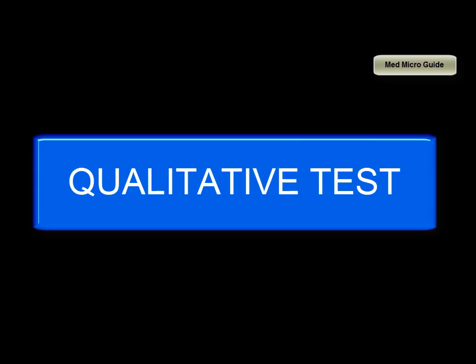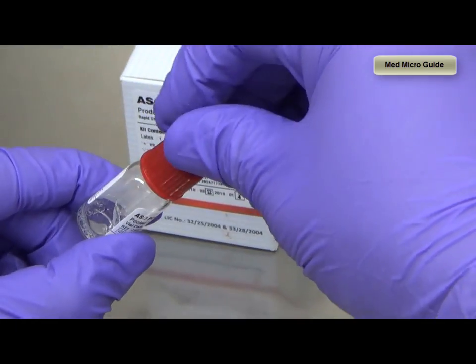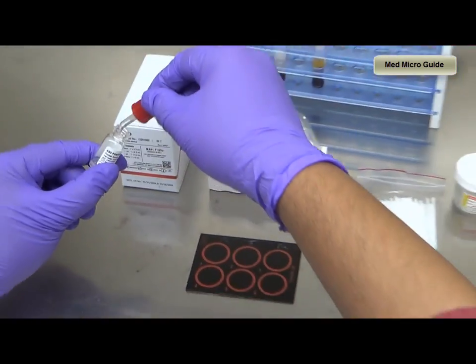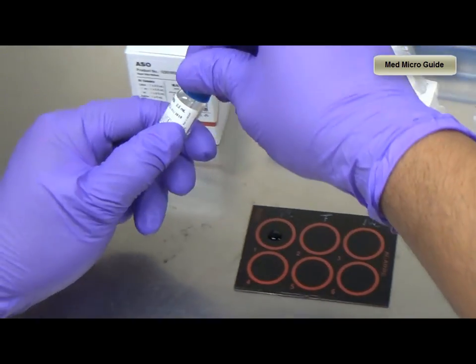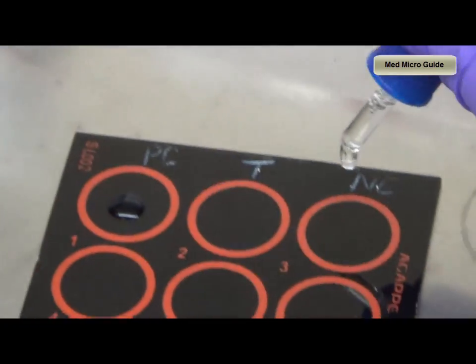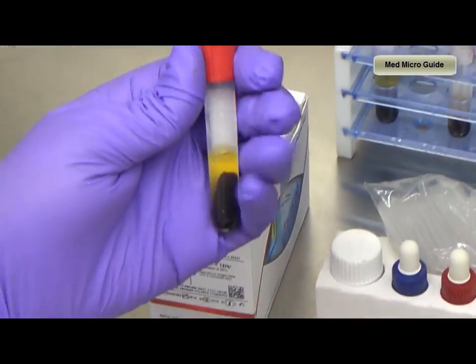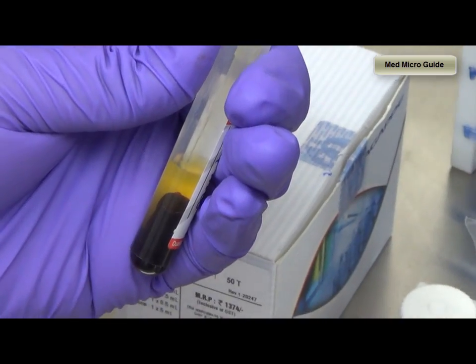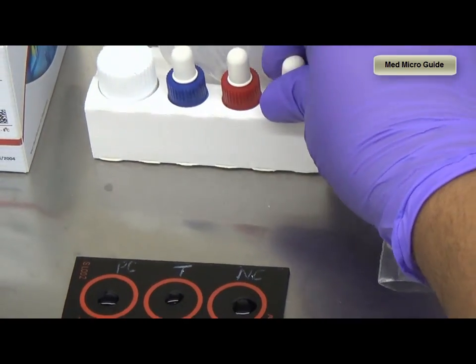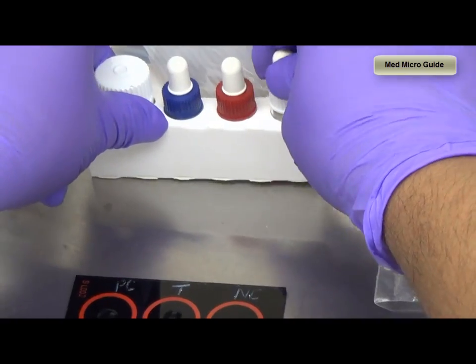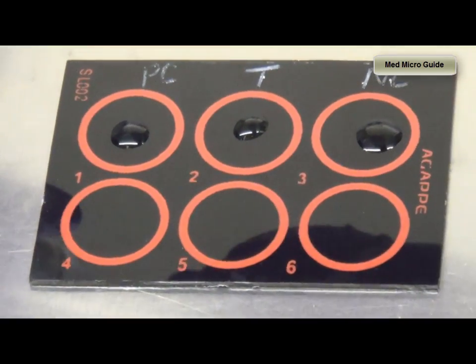Now we will see the qualitative estimation of ASO. The slide is labeled for positive control, negative control, and test sample. We will add one drop of positive control to the well and a drop of negative control. We will add a drop of serum — or we can add the volume of serum as described by the kit literature. In this case, I am adding 50 microlitres of the test serum. Now we will add one drop of the ASO reagent to each of the circles.